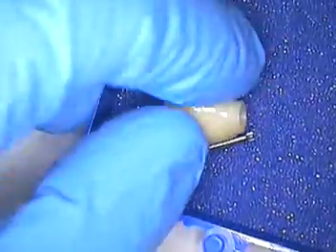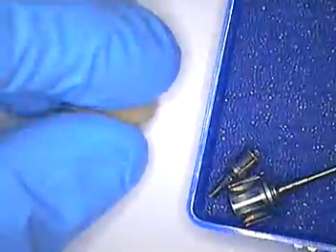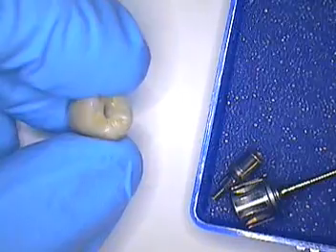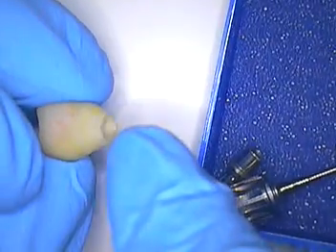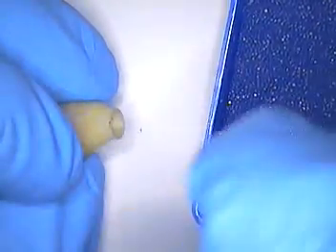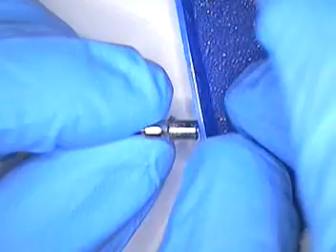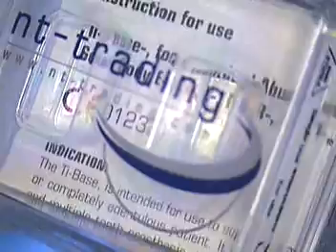There are a couple of components that go along with this case. Number one, the zirconia crown itself — fully contoured and glazed and ready to go for my final fit check. It does not have the titanium component yet; it was shipped to me separately to check against the model. Not only that, but the screw as well. This component is from a company called NT Trading.